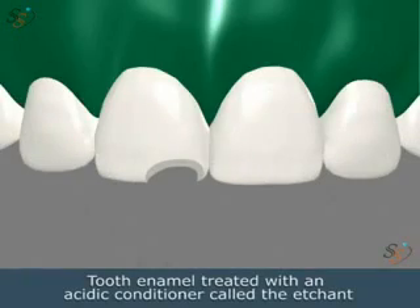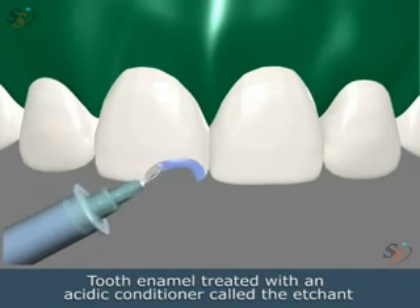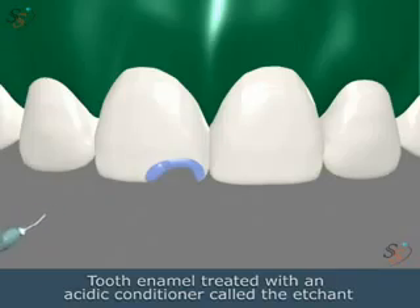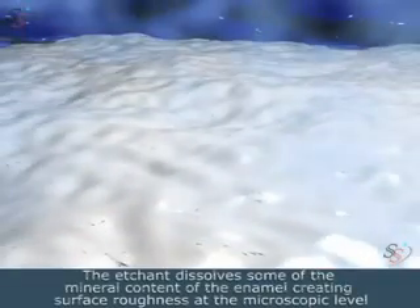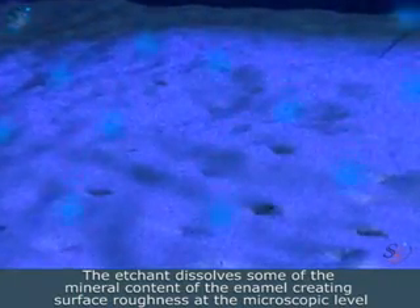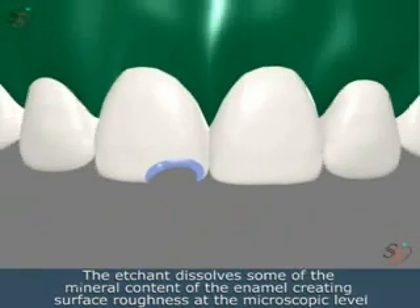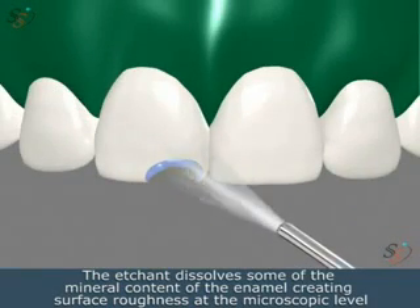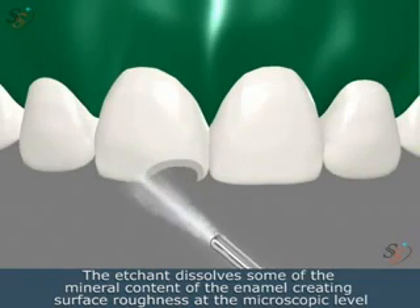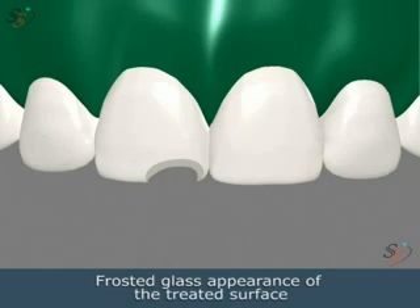The tooth enamel will be treated with an acidic conditioner called etchant. The etchant dissolves some of the mineral content of the enamel, creating surface roughness at the microscopic level. A frosted glass appearance of the treated surface appears after the etchant is introduced.